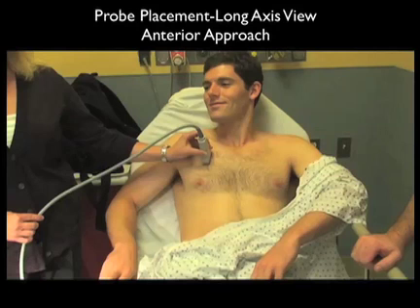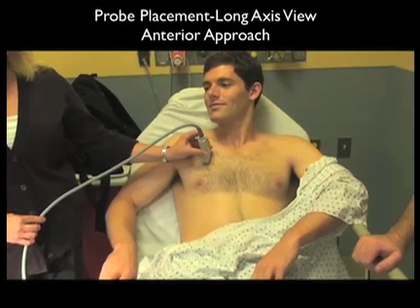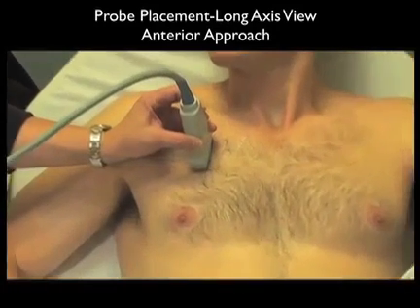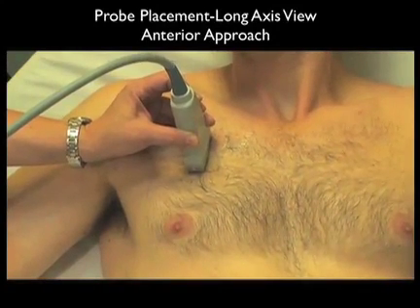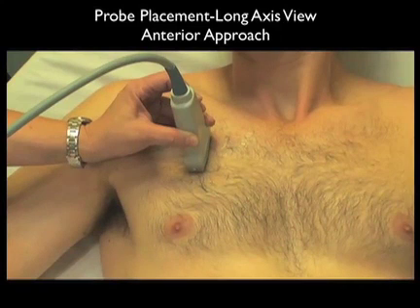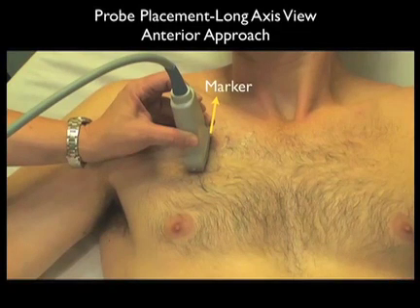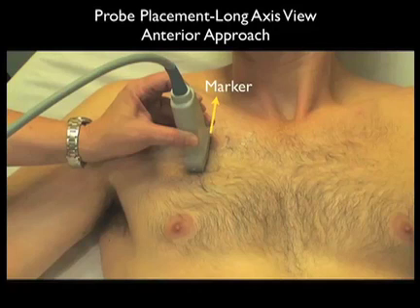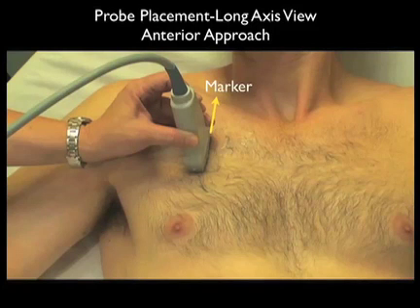Now let's learn how to perform the ultrasound examination for pneumothorax detection. Here we have the high-frequency linear type array probe positioned on the anterior chest wall, at about the mid-clavicular line, looking into about intercostal space 3. Now in most cases of pneumothorax with the patient supine, the air would be predominantly seen in this area. Note we're looking in a long axis configuration between the ribs with the marker dot oriented superiorly towards the patient's head.